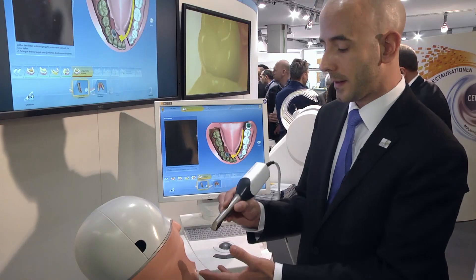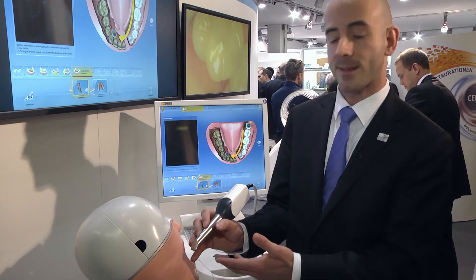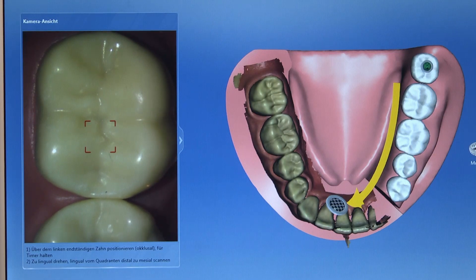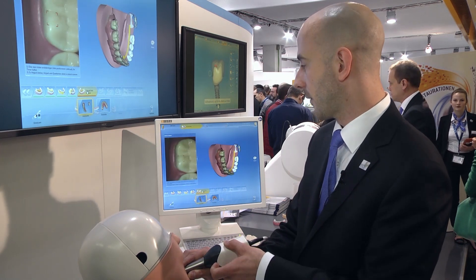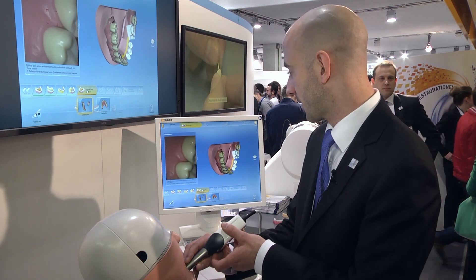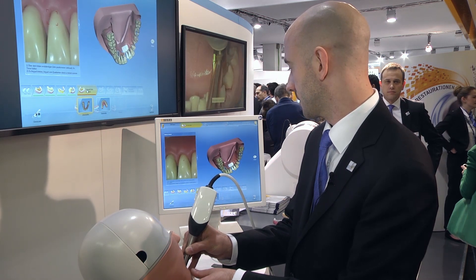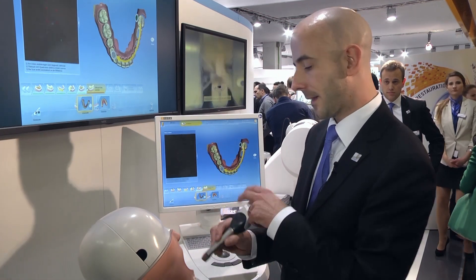The great thing is, we did the same movement time and time again — placing the camera in the mouth at the distal, moving it mesially — repeated three times for each quadrant. The second quadrant is scanned the same way. We begin on the occlusal of that terminal molar and come down the lingual surface, and the software joins the two quadrants together.